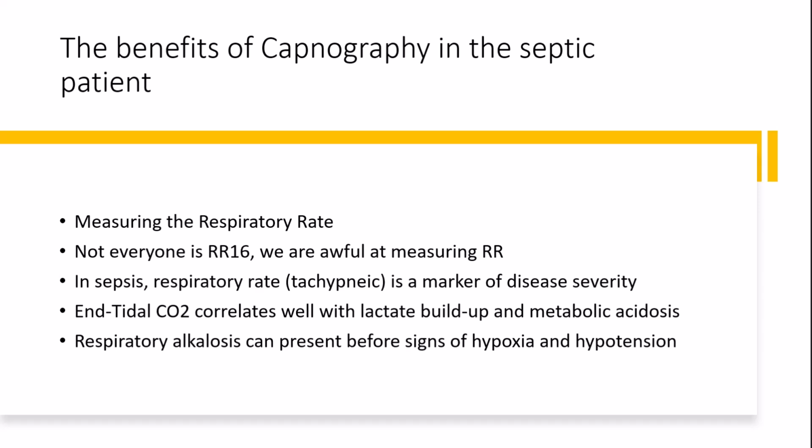As well as that, end-tidal can allow us to see what the CO2 measurements currently are with that patient, and in, I guess, a case of sepsis, potentially guide us towards whether this patient is in metabolic acidosis. If the end-tidal measurement is less than 25, we could then start to consider that the lactate levels may be above 4, and this patient needs to go to hospital to get a blood test done and to confirm that this patient is having a severe infection.